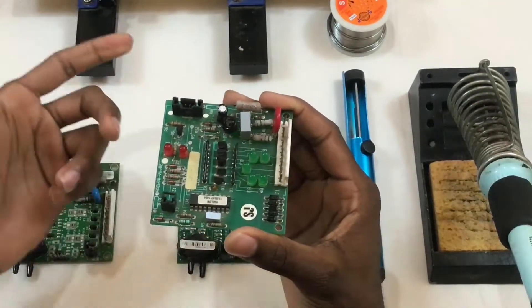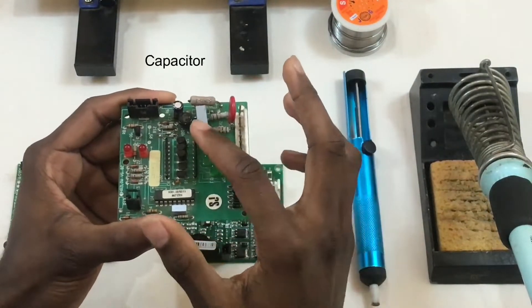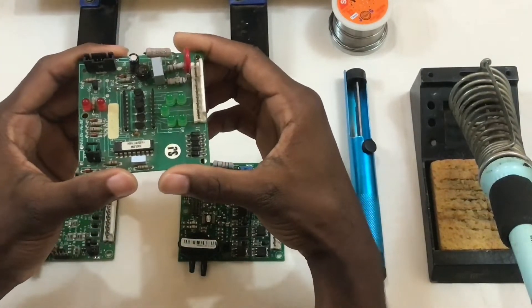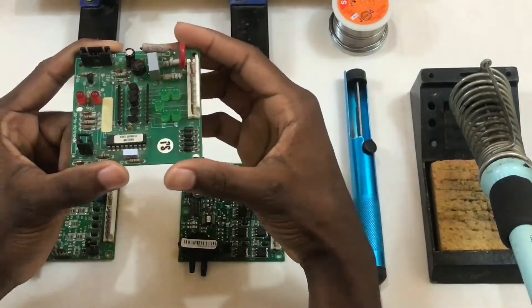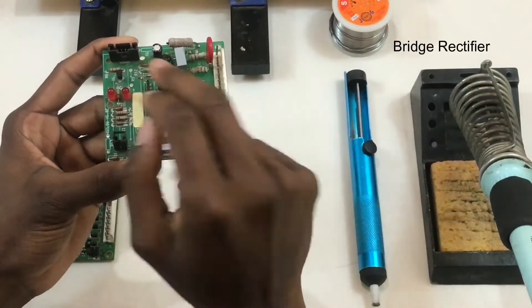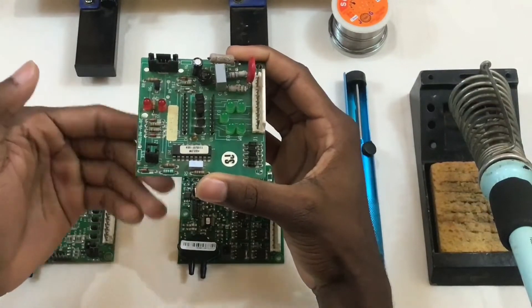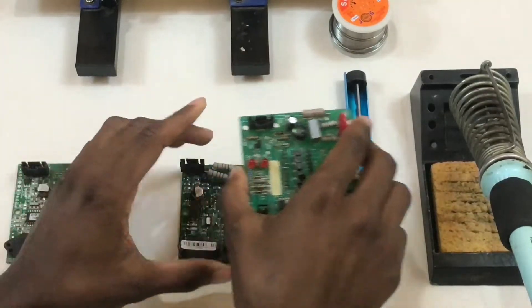After the varistor, we have these two resistors — they are 1 ohm, 1 watt resistors, also used to protect the board from power surges. After the resistors, we have a capacitor: a 100 nanofarad, 310 volt capacitor used to store charge on the board. It also blows up when damaged, so you can actually see if it is damaged. After the capacitor, we have the bridge rectifier, whose main function is to convert AC voltage to DC voltage, which is then fed to all the other components on the board.